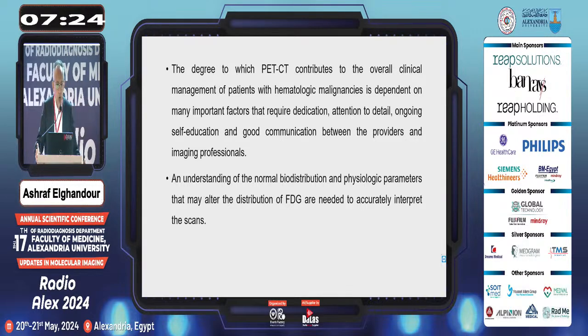The degree to which PET-CT contributes to the overall clinical management of patients with hematological malignancy depends on many important factors that require dedication, attention to detail, ongoing self-education, and good communication between the provider and imaging professionals. That's what I'm asking now. An understanding of the normal biodistribution and physiological parameters that may alter the distribution of the tracer is needed to accurately interpret the scan. I'm going to give an example now.